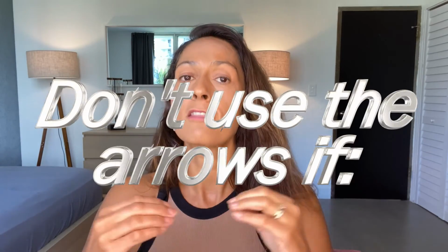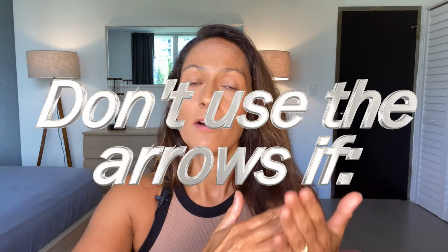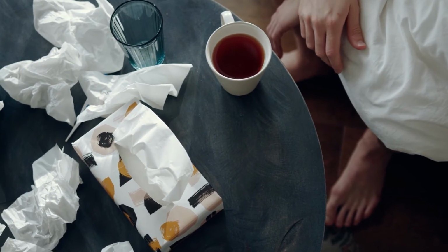The Endocrine Society recommends not to use the Dexcom arrows in the 4 hours after you've had a meal with an insulin dose. They also recommend a less aggressive dosing adjustment strategy for older or fragile adults, just to lower the risk of low blood sugars. And another thing they mention is sick day and medication considerations. Some medications, even over the counter, can interfere with your Dexcom readings. So if you're sick, if you're taking new medications, they recommend to not rely completely on your Dexcom readings, but do finger sticks occasionally.